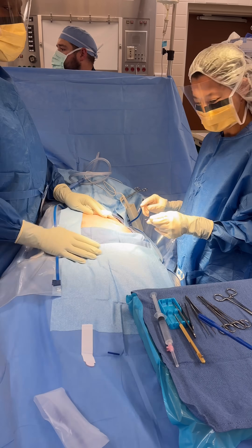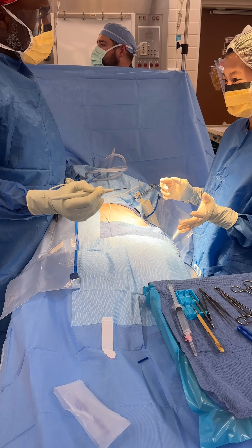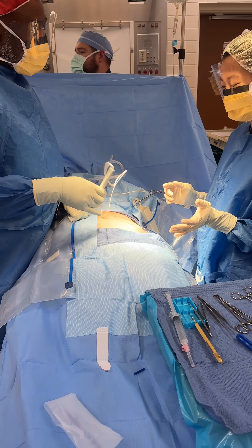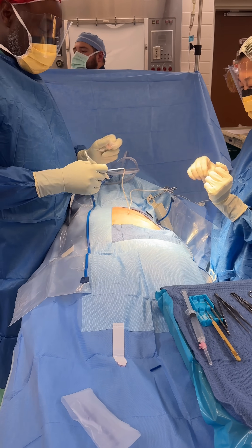With that. You know how to use that? No. It's simple. Cut — you go through the dermis. And then you get all the way around through the dermis and you use the coag. Got it? It's like a pen. Don't do it like this — use it like this. Okay?